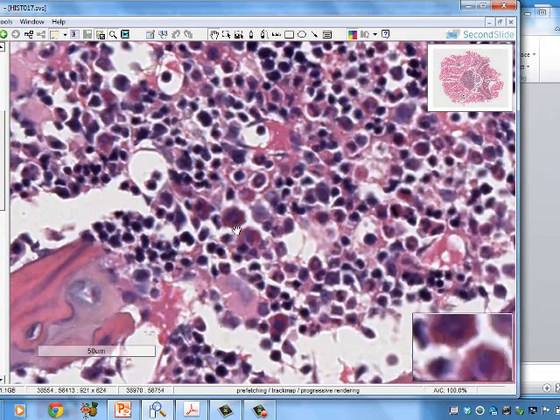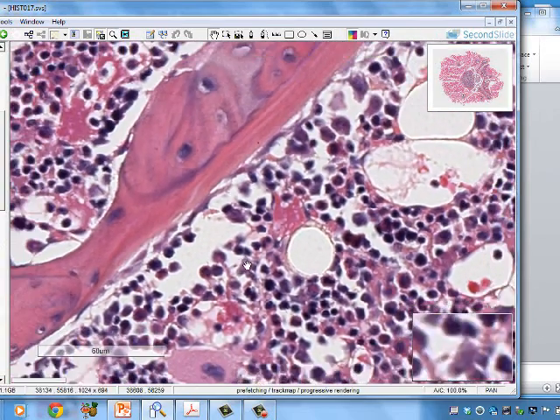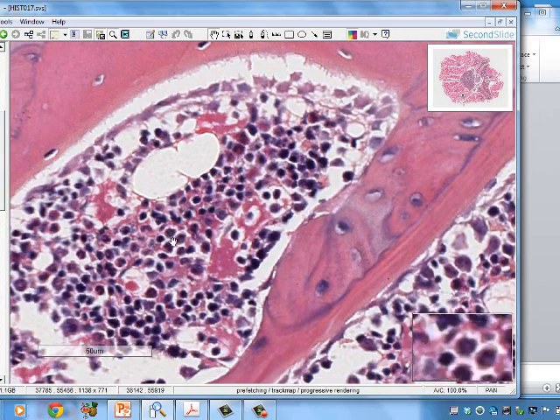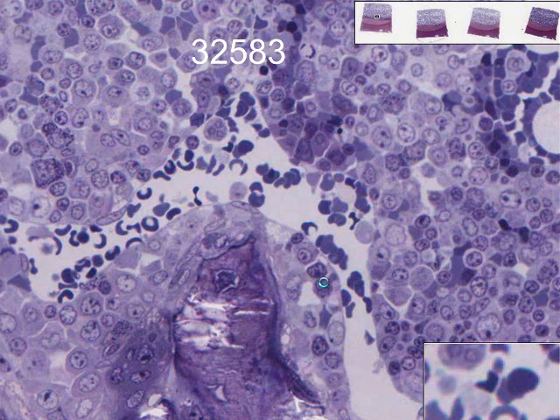And you can see there's granules in the cell, megakaryocytes in through there. You can see some eosinophilic ones that are developing along the way. Now, not the ones on the edge, they're bone cells, so it's in the marrow itself, in between the spicules of bone. And so we can see those. Here's another one that we can see. This is in the bone marrow, so this is cartilage in through there, and then this is spongy bone.